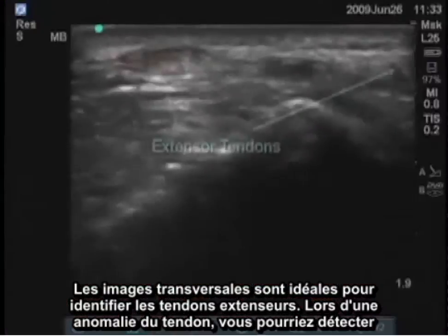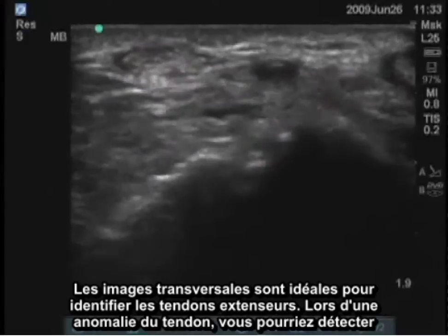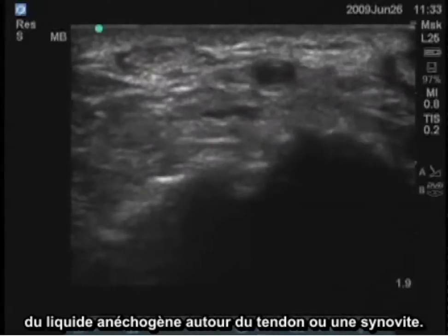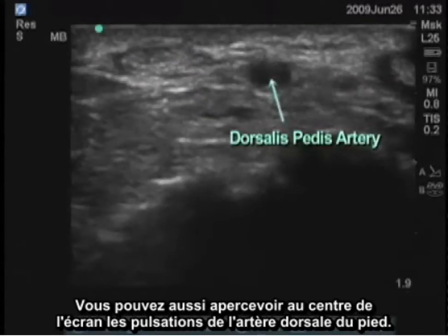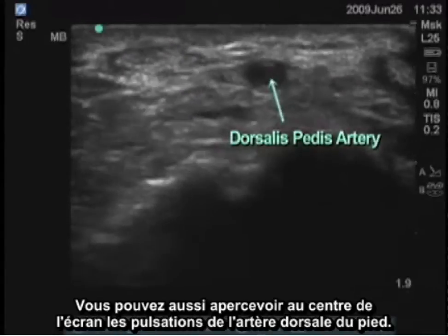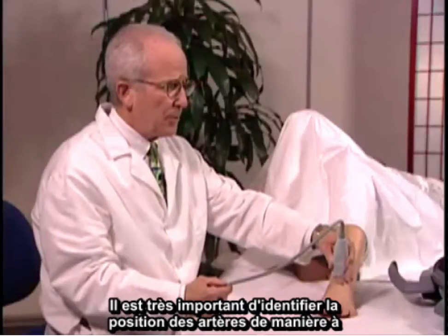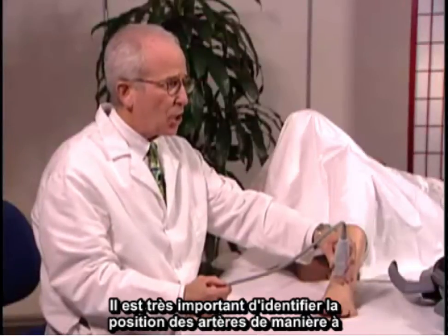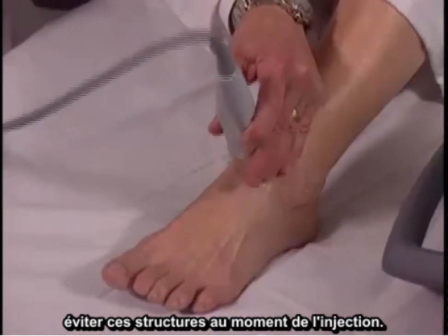For tendon abnormalities you might see anechoic fluid around the tendon or synovitis. You can also see in the middle of the screen the dorsalis pedis artery pulsating. It's very important to identify the position of the arteries so that when you do injections you'll be able to avoid them.